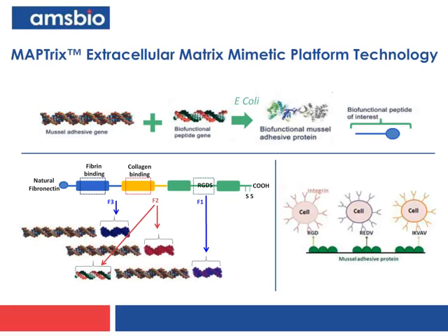Now, lastly, I just want to expand a little bit that concept of 3D into how we can really design our own environments for cell-based assays. And for that, we use a new tool called Matrix. This is a technology that uses the backbone of a mussel adhesive protein, so it's completely xeno-free. And we introduce a peptide derived from extracellular matrix, in fact, from any protein, into the backbone.